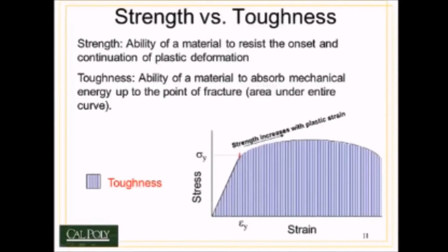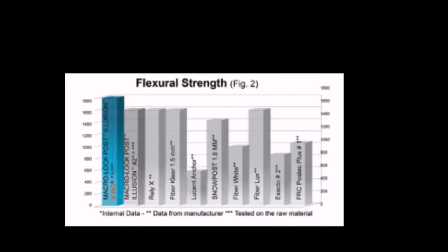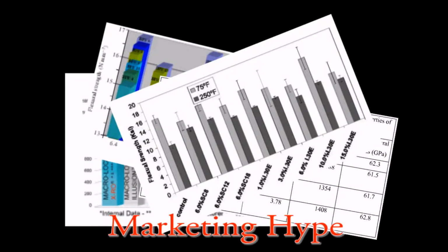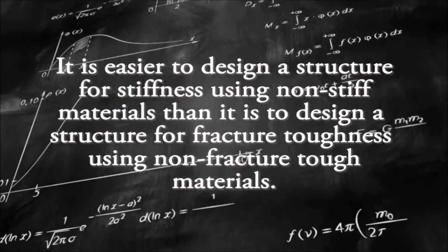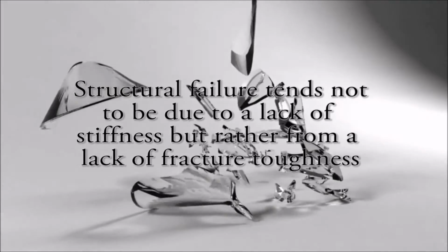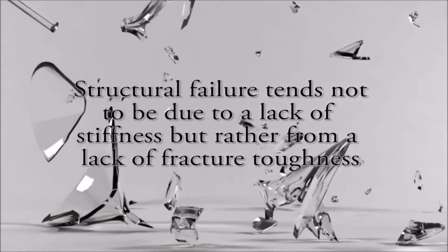Fracture toughness is the quality of a material to resist the rapid propagation of cracks. Marketers of glass fiber reinforcement sometimes try to use flexural strength and flexural modulus, which are measurements of stiffness, to try to suggest clinical performance. However, any structural engineer will tell you that it is easier to design a structure for stiffness using non-stiff materials than it is to design a structure for fracture toughness using non-fracture tough materials. In other words, structural mode of failure tends to not be due to a lack of stiffness, but rather is due to a lack of fracture toughness.